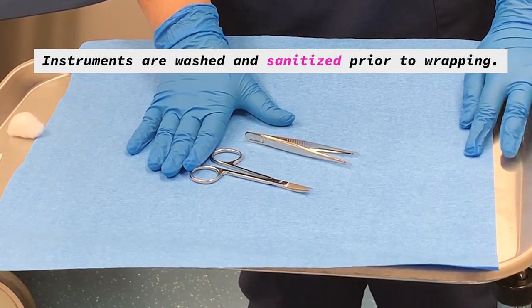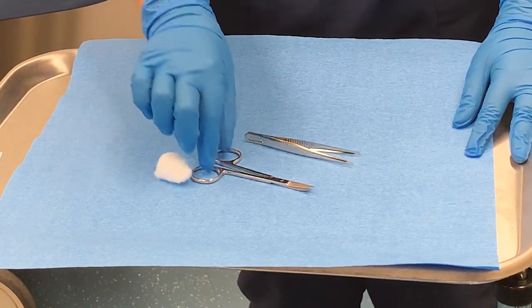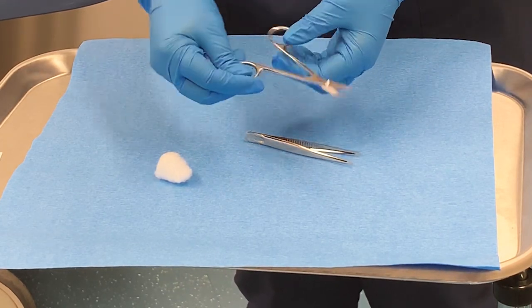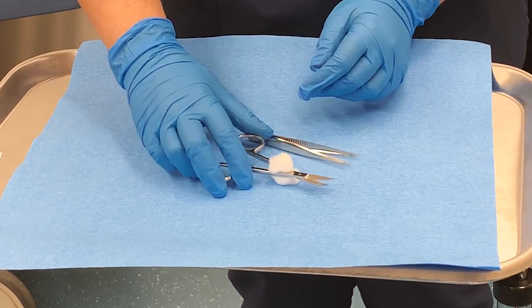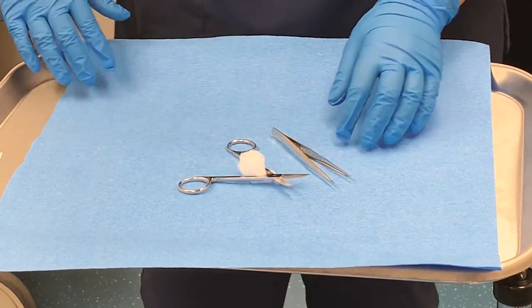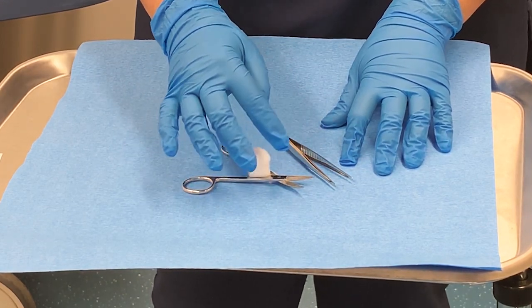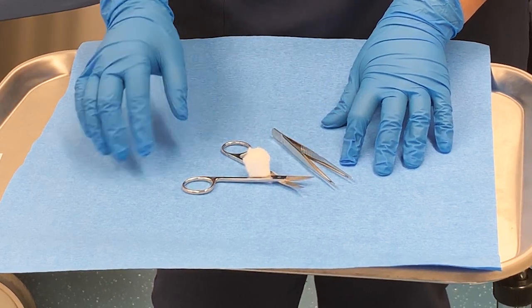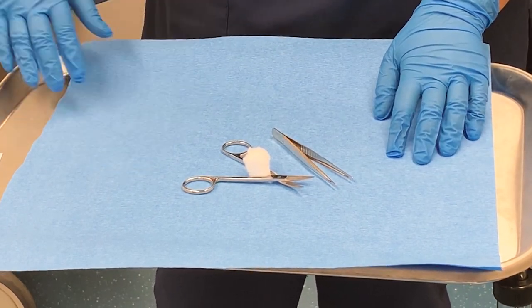First, you have to wash and sterilize your instruments — these are already washed. Next, you're going to put the cotton ball inside anything with hinges. Our scissors here have hinges, and we're going to place it in between like this, just so that our instruments stay open while they are autoclaving. Some facilities don't like having cotton balls in the hinges — some prefer gauze wrapped around the tip of the scissors, or some places don't want a cotton ball at all and you just leave the hinges open. So check your facility for their preference.